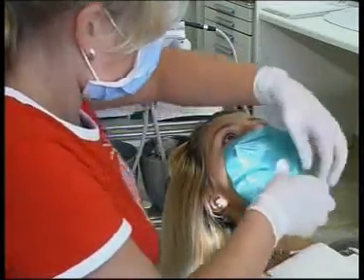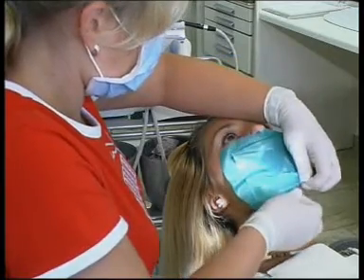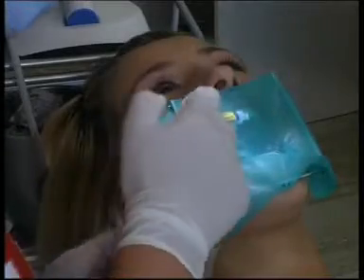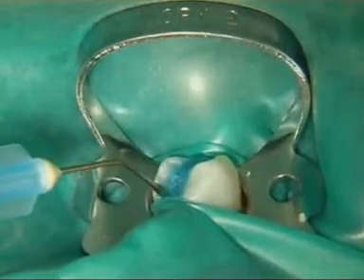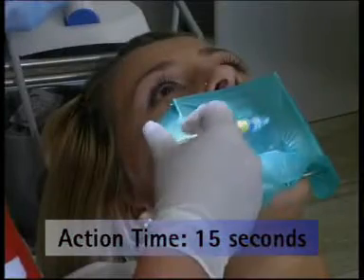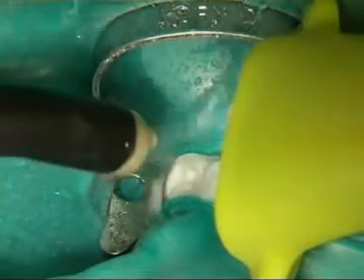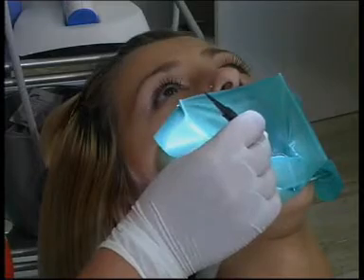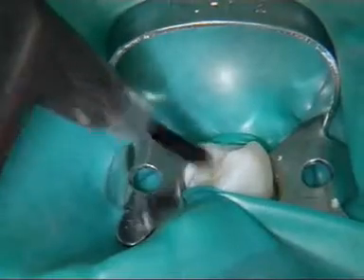You should now use a rubber dam for the patient's protection. A 35% solution of phosphoric acid is applied for 15 seconds to etch the enamel. Use the multipurpose syringe to rinse the solution off and then dry the area. Be careful not to over-dry, otherwise the adhesive layers and bond may not disperse correctly.